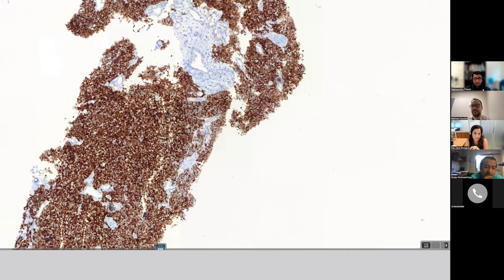When do you guys do NUT staining? Like, what panel does it have to be for you to add a NUT stain to your panel? Sorry? That's a great question, Matt. Yeah, go ahead, Irene, you go first. No, I didn't understand the question. Sorry. No, I was just asking when do you do the stain for NUT? Like in what scenario, what immunoprofile? Like when do you add that to your workup?